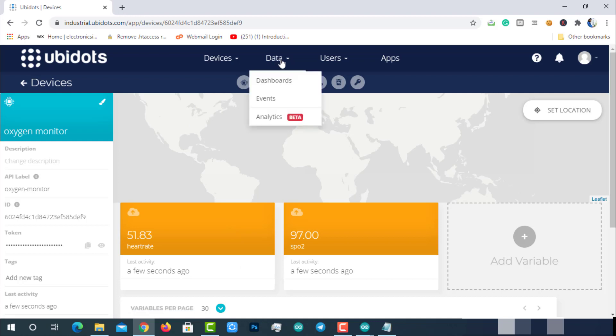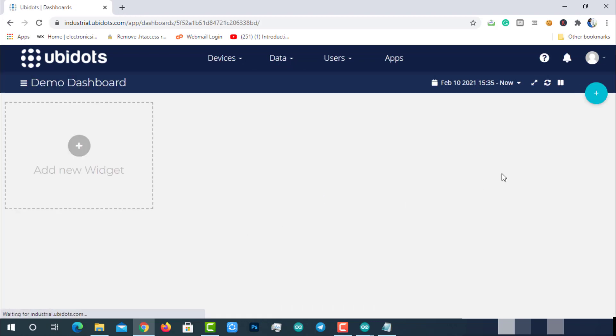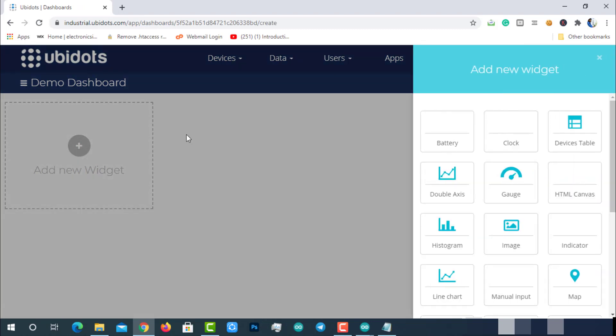Now let's visualize the same data. For that, choose dashboard from the data dropdown menu. Click on add new widget. You will be prompted with a bunch of data visualization options - choose one among them.